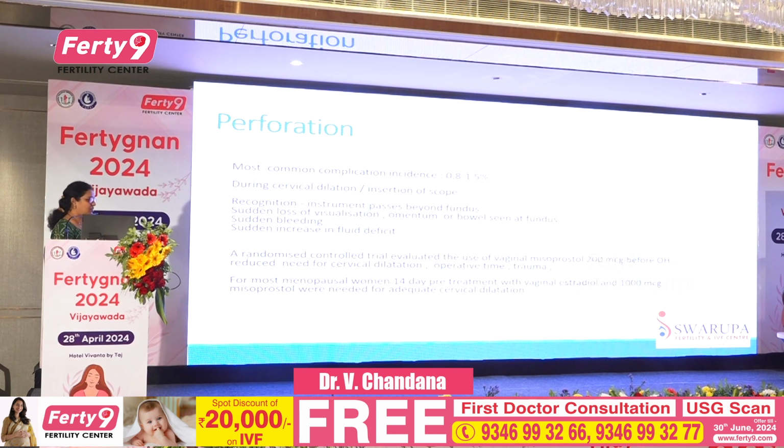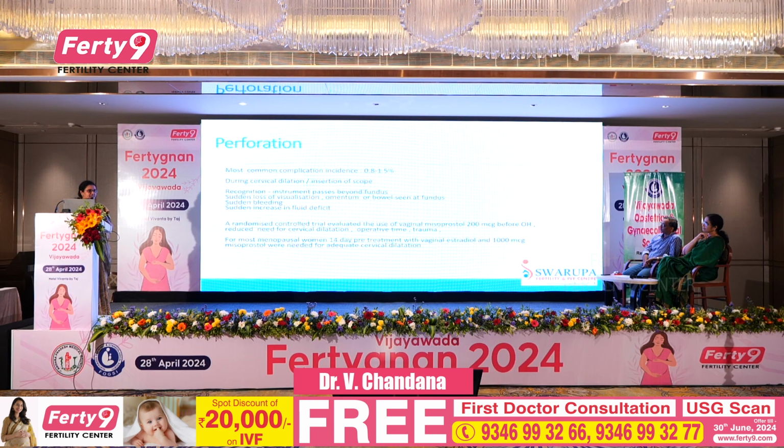And sudden bleeding. Your visualization was very clear, but suddenly you will find there is more bleeding. Suddenly you will find that the fluid deficit has increased, because whatever fluid you are pumping is going into the abdominal cavity. So the deficit definitely will increase. So these are the earliest signs of perforation.